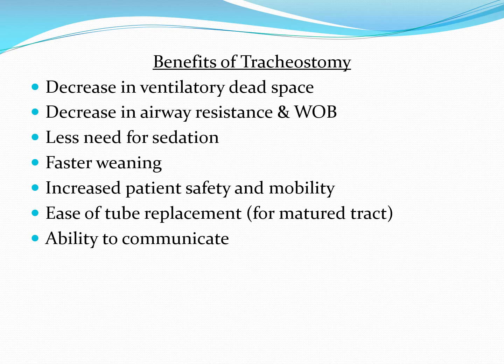It also imposes much less resistance, thereby causing much less work of breathing. That is the work of breathing that would be associated with an artificial airway. Because it's much shorter, it would impose less resistance and better facilitate breathing, in particular spontaneous breathing, which is really what we want for our patients that have artificial airways and have mechanical ventilation.